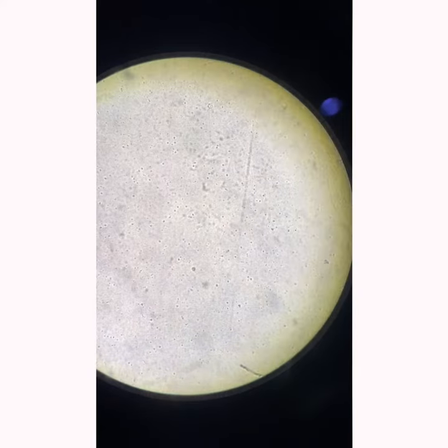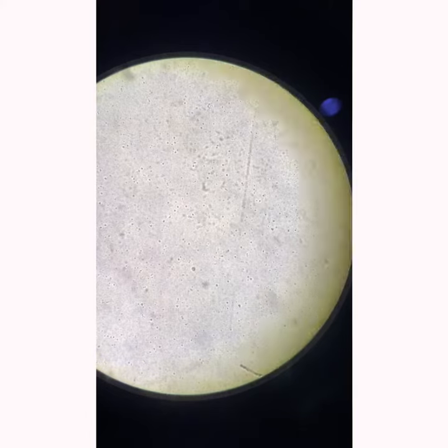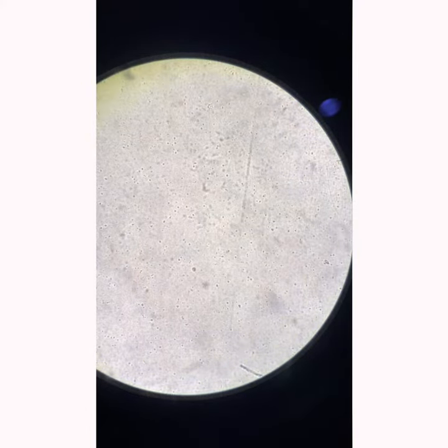The Neubauer chamber will then be examined under the microscope for the WBC counting. If the RBCs are not properly lysed, they can still be visible under the microscope.